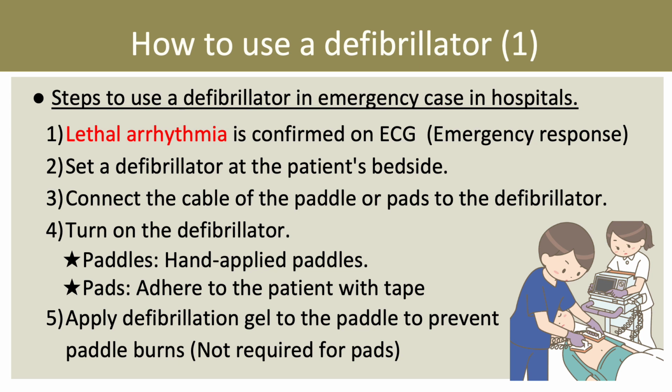Every minute counts in treating the lethal ventricular arrhythmias, therefore defibrillation must be performed as soon as possible. In this lesson, the goal is to become able to perform defibrillation quickly in case of emergency by learning how to use a defibrillator. The device introduced in this lesson is the DC defibrillator that is used in medical facilities.